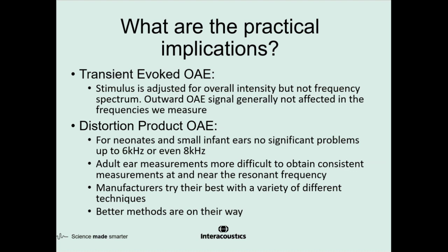And I will just finish this section by saying that many manufacturers are acutely aware of the issues around this, and they all tackle it in different ways to try and optimize things for you. And there's no doubt about it that on the horizon there are new techniques, forward pressure, emitted pressure, etc., which will slowly appear on clinical instruments in the years to come.